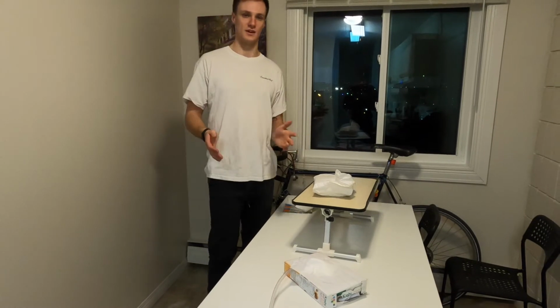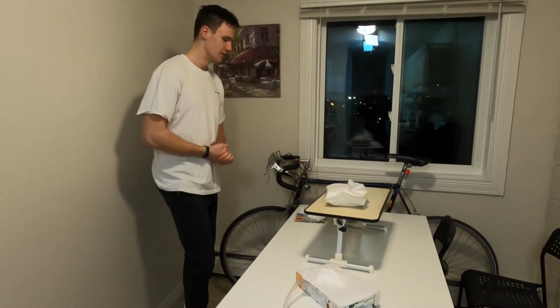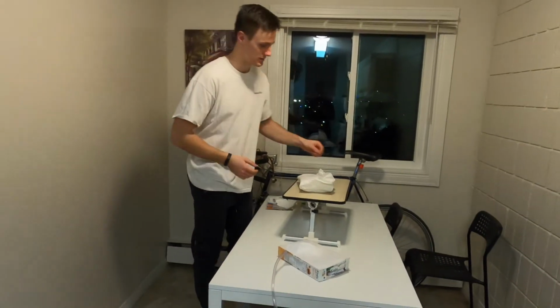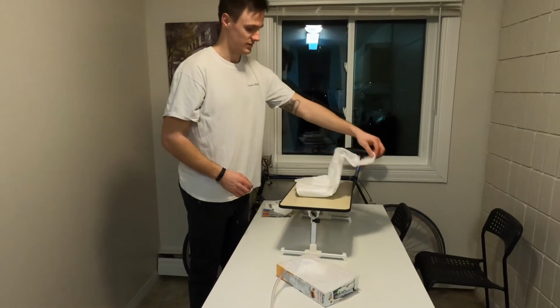Do you have any questions? They say no. Would you like to proceed with this? They say yes. So we can go ahead and get started. So I'm going to prepare my sterile field here. So I'm going to wash my hands and open this away from myself here.